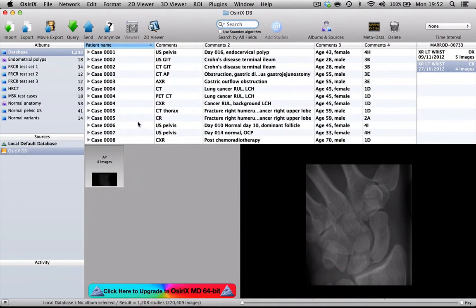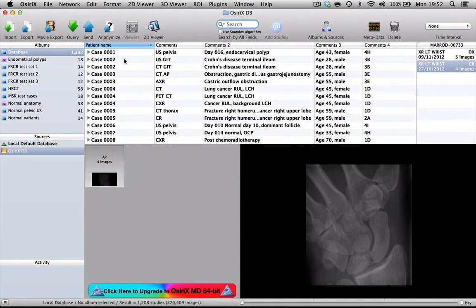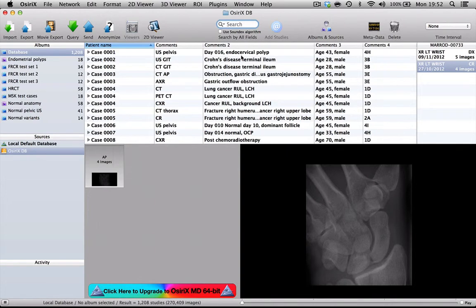This is a list of all the cases in my central database. They have been anonymized and they're coded with a case number, also by modality and body part. And then all the keywords relating to the findings or the diagnosis are listed in this column here.